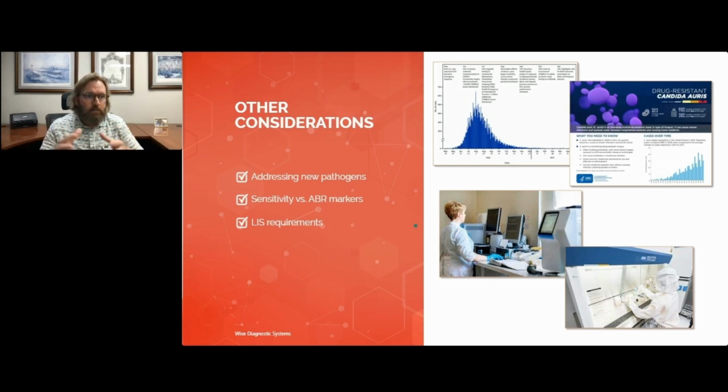Typically, the outlier is going to be on the technical side, because they have to more or less wait for the clinical side to get done to then be able to test and apply those changes or additions, or if you're doing it from scratch, those panels, to test them in a test environment before you actually go live with it. So that's just something to keep in mind: talk to your IT folks early on, so that you don't get done and say, wow, we're great, we're ready to go with these panels, only to find out that there's really nothing ready on the technical side, which means you can't really report anything out until you've completed that.